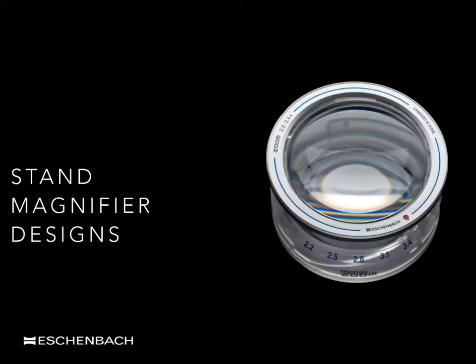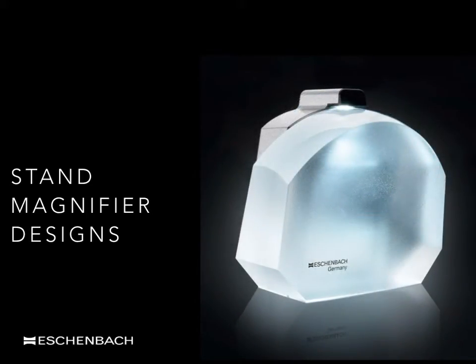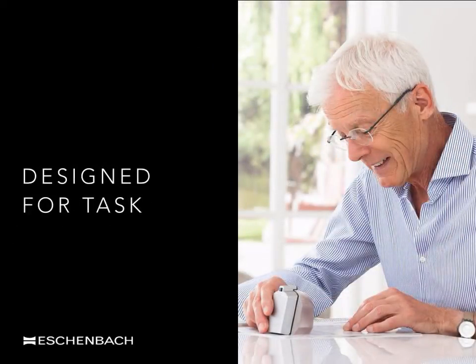With the advantage of having the magnifier sitting directly over the page, there has been the development of a diverse range of designs that may incorporate more than one lens. The Macrolux, although slightly heavier than the equivalent powered hand magnifier, is still light enough in weight to move up and down a column of print. With the lens sitting flat onto the page, the unique Ceratec hard coating prevents scratches if any debris has become trapped underneath. The gentleman here has placed the Macrolux directly over the column of print and the unique shape of the lens allows a whole line of print to be viewed at any one time. Although he will still need to move the magnifier up and down the column of print while reading, he may leave the magnifier on the print at any time, allowing for a hands-free option.